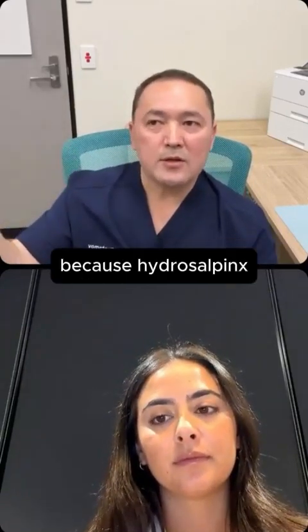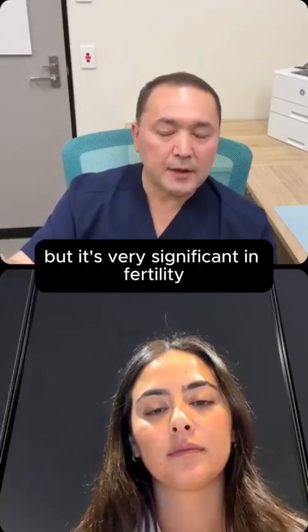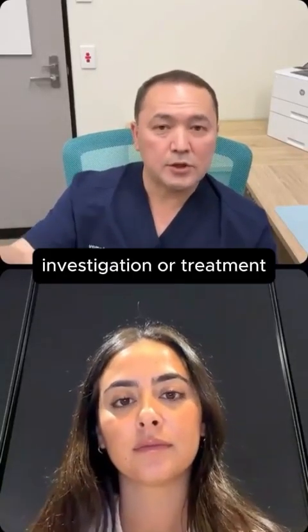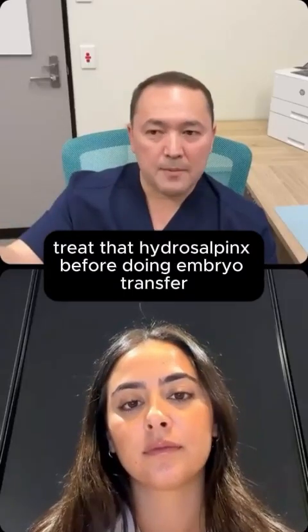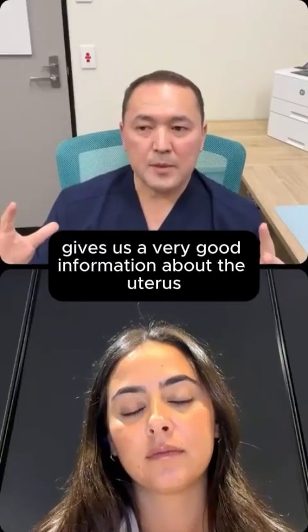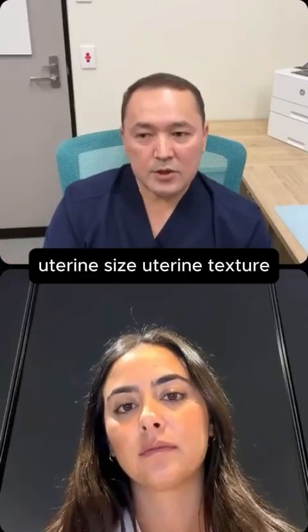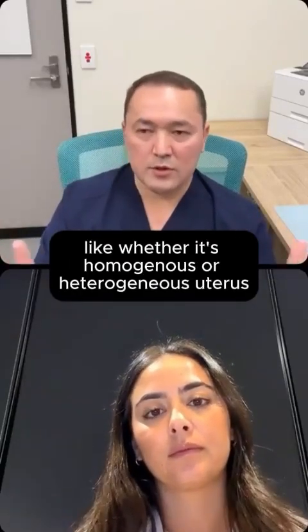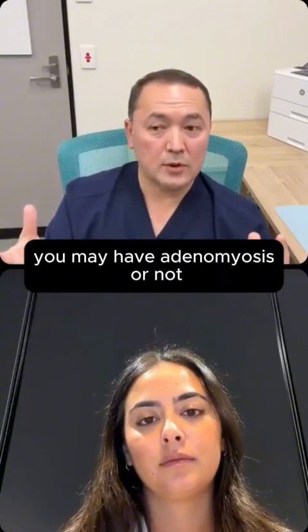Why? Because hydrosalpinx may not be that significant in gynecology, but it's very significant in fertility investigation or treatment. If you have hydrosalpinx, that can reduce the chance of implantation, so we need to treat that hydrosalpinx before doing embryo transfer. Fertility ultrasounds can also give us very good information about the uterus, uterine size, and uterine texture, like whether it's a homogeneous or heterogeneous uterus, which can tell us whether you may have adenomyosis or not.